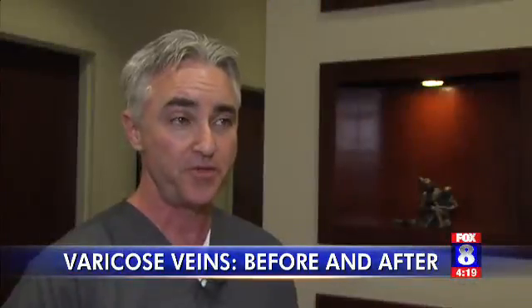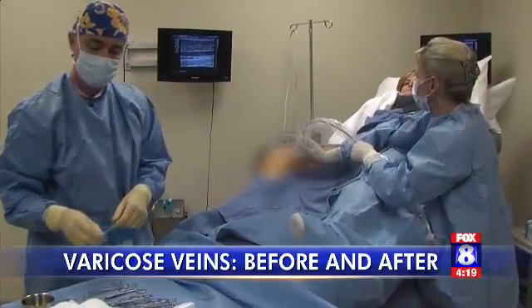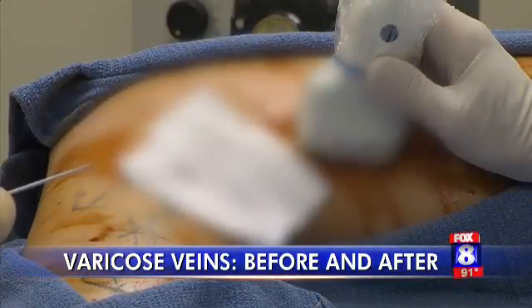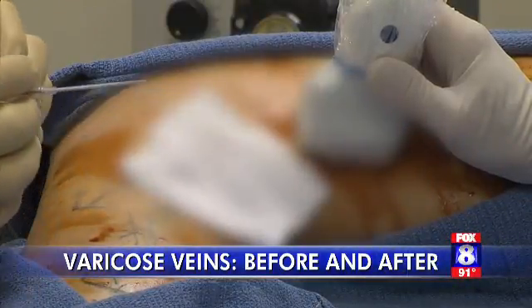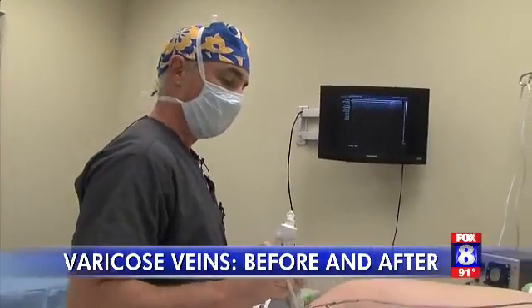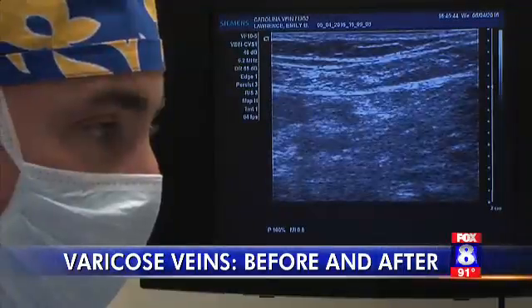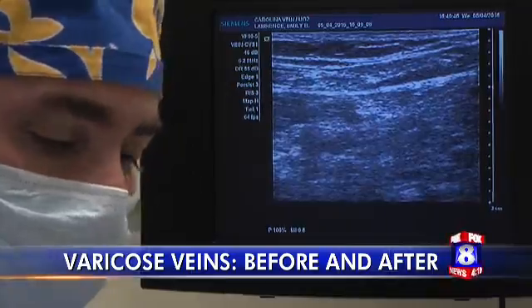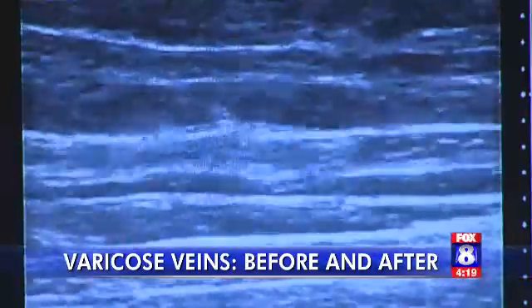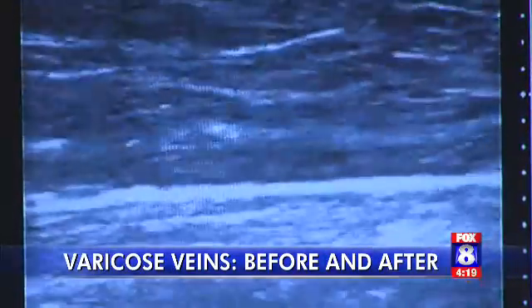When we treat the main source veins like the one that you're going to have today, that vein should never be a problem again. The whole time, ultrasound is used to see everything happening under the skin, including a catheter as it enters my vein. Once it's in place, the ClaraVein wire will be guided up the vein to the top of my thigh, where the spinning begins. When I start, you're going to feel this funky vibration sensation. He's not kidding — it felt like the vibration of a cell phone on my leg. I could watch the whole procedure on a monitor next to the bed as Dr. Greenberg slowly retracted the wire.